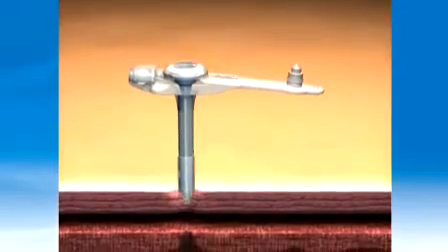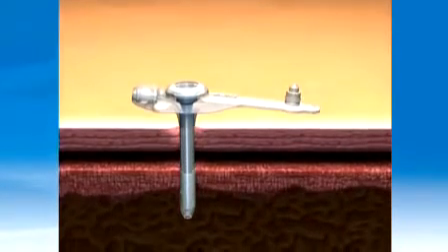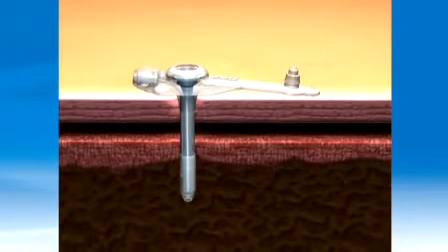Various medical conditions may make it difficult or impossible for a person to eat orally, denying the body of essential nutrients. In such cases, your physician will select the best type of alternative feeding for your situation. A gastrostomy tube, also known as a G-tube, may be inserted through the abdominal wall to provide direct access to the stomach for feeding. The MiniONE Balloon Button is a low-profile or skin-level G-tube. A G-tube is a convenient and effective means for delivering nutritional formulas to the body.